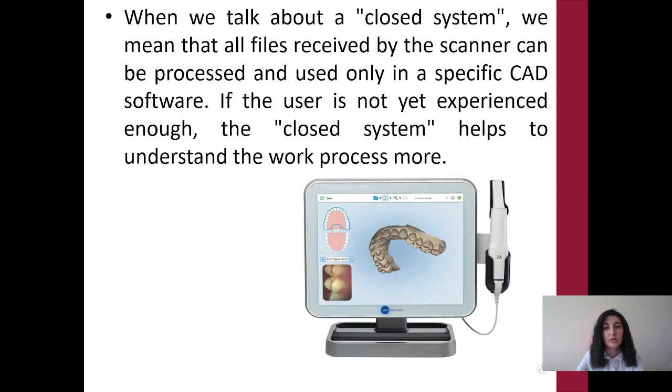When we talk about a closed system, we mean that files received by the scanner can be processed and used only in a specific kind of software. If the user is not yet experienced enough, the closed system helps to understand the work process more.